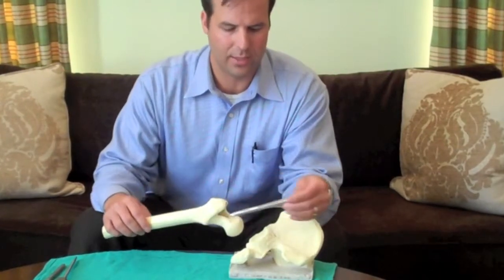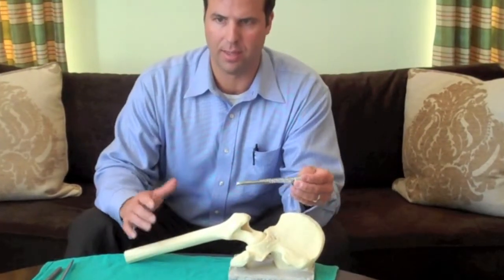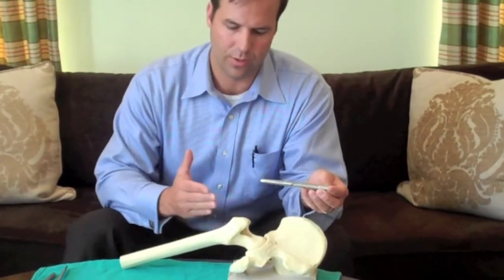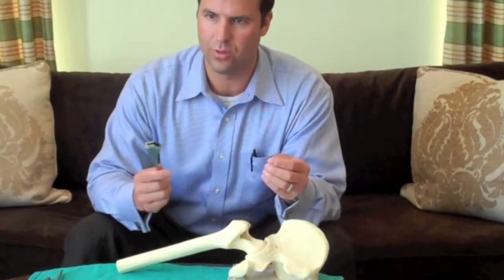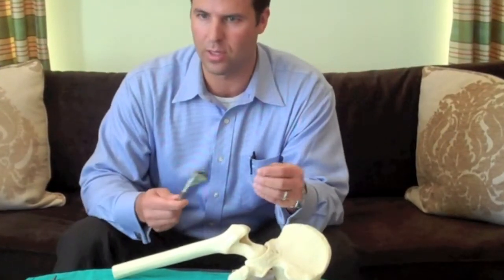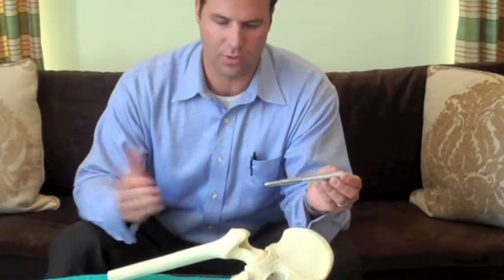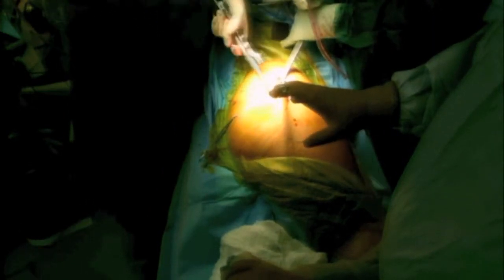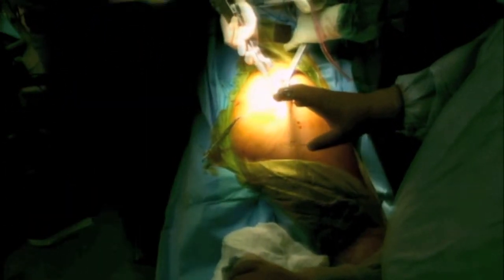The key to the In-Site-2 Leg Link Guide is that by preparing the femoral canal before the anatomic relationship between the femur and the pelvis have been altered, the surgeon can use the implanted femoral broach as their primary reference point for measuring leg length and offset. The In-Site-2 Femoral Leg Link Guide starts with the surgeon using the In-Site-2 Femoral Preparation Technique and broaching up to the appropriate size broach they intend to use for their femoral component.